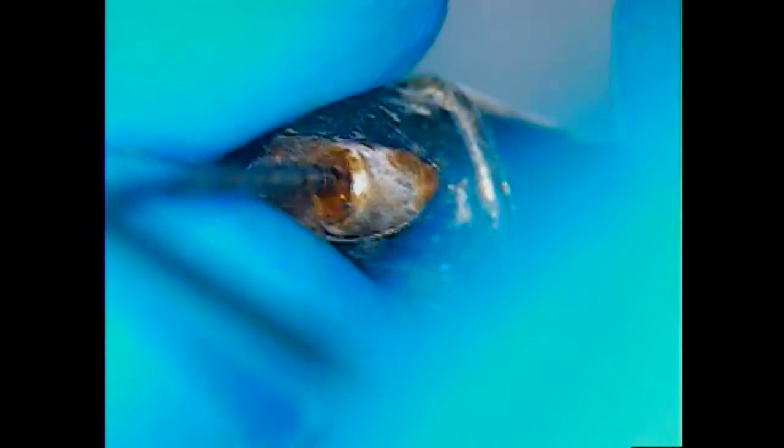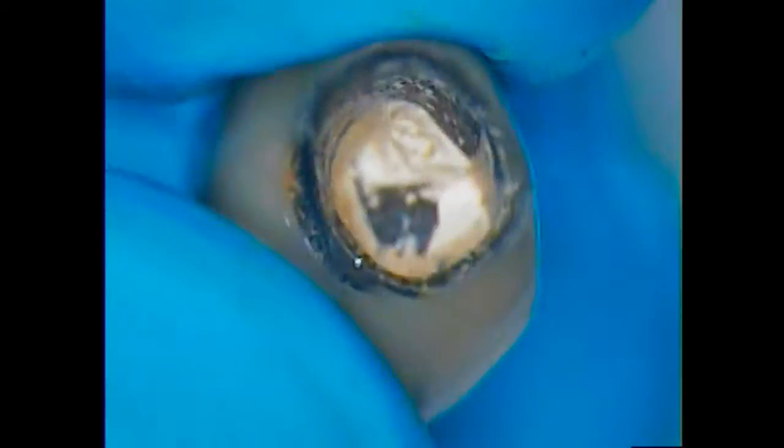We don't really know why the screw fractured in this case. It could have been the load from the bite, it could have been tightening, it could have been a number of things. We know there's a crown with it and it fits properly with the abutment. There is some cement inside that we're going to clean out — all that is temporary cement. It goes into a temporary cement cleaner remover for about 10 minutes in a bag, and then we'll have it all cleaned up and ready to put back in.